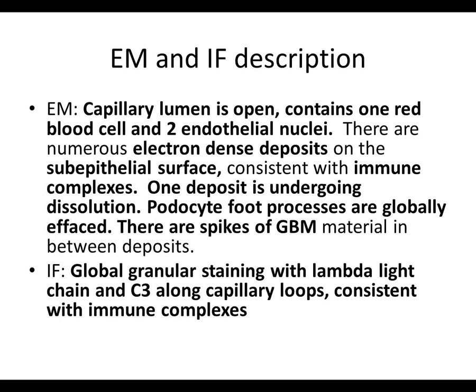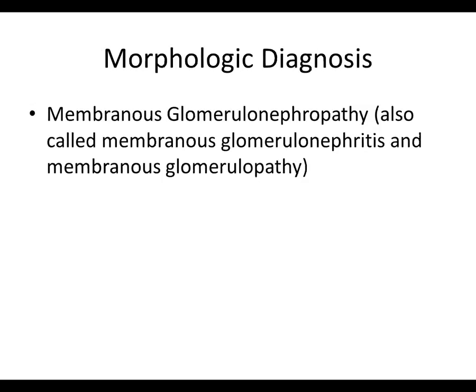So if it's just bright staining or splotchy staining or blush staining or whatever, the granularity is actually indicative of immune complex disease, whereas all the other patterns can be somewhat nonspecific, and can actually be artifacts. So splotchy staining can be artifact and it can be nonspecific. So granularity is what you really want to look for.